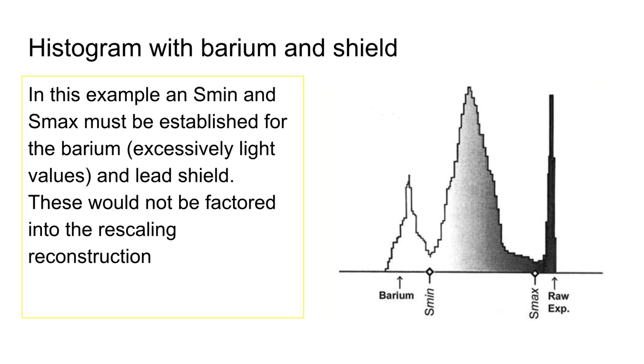That's why it's hard to shield in CR sometimes, because if one edge of the shield, and this happens all the time on a chest x-ray, you have it down here, you're protecting the gonads, but the bottom of the shield shows up in your image, it could cause a rescaling error. This goes against everything we were taught when I went to school. There used to be a term known as you had to show evidence of shielding. If they didn't see the shield, then how do we know you shielded? So now there's a little controversy here.